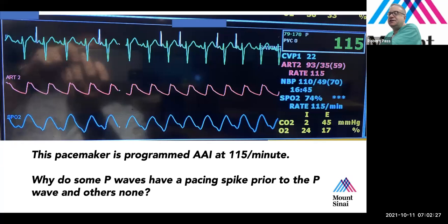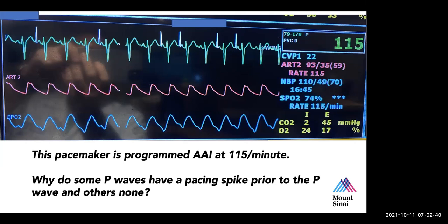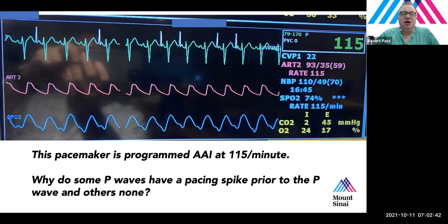Let's say, Sergey, that you are standing at the screen for about 10 minutes and it never changes from 115. If that were the case, then you'd have to think that what you said is not true. Because most people's heart rate varies at least a couple of beats per minute over a few minutes. So I give you credit for that. That's a good answer. Any other good answers? There's one other explanation that I thought I should mention.